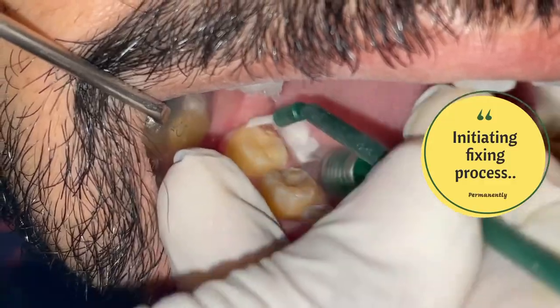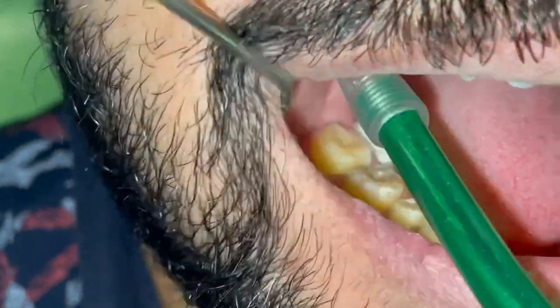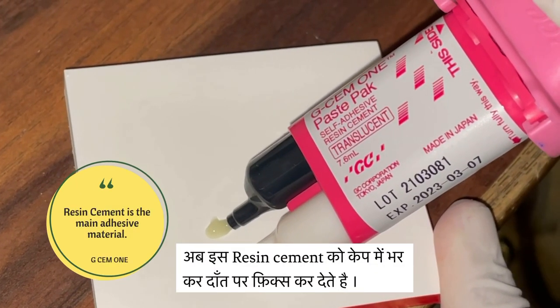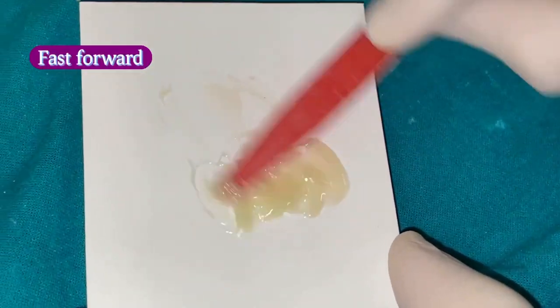Now we are finally going to fix the crowns permanently — enjoy the video and you can see all the steps. For this purpose, we use light-cure resin cement, which is used as a glue to fix the crowns to the teeth surface.